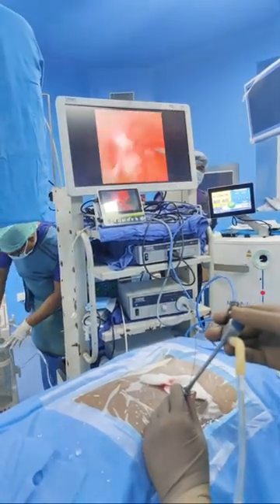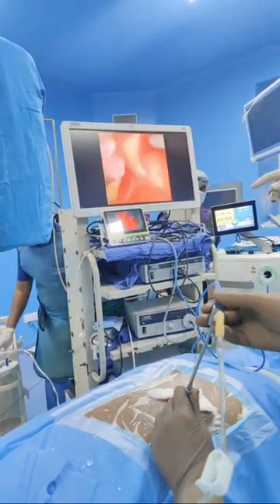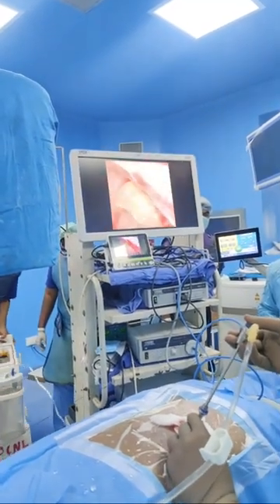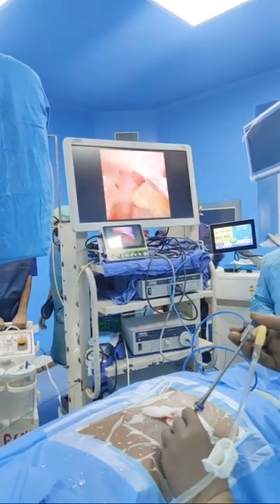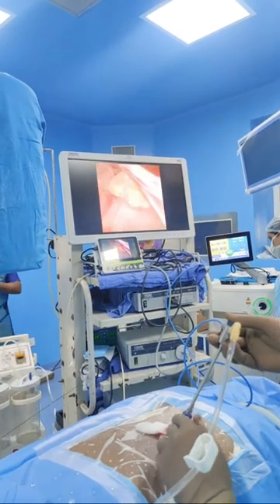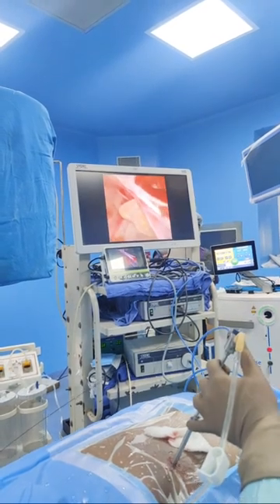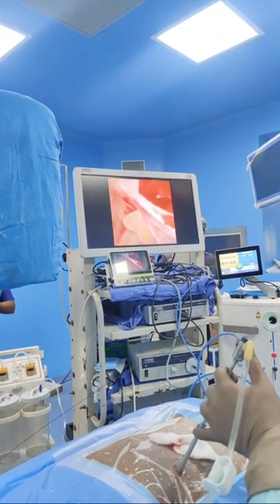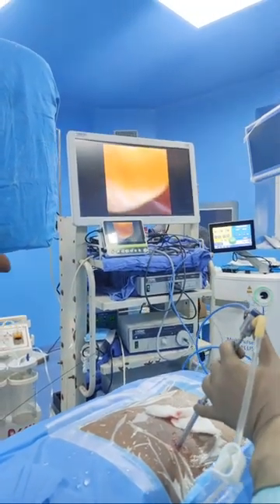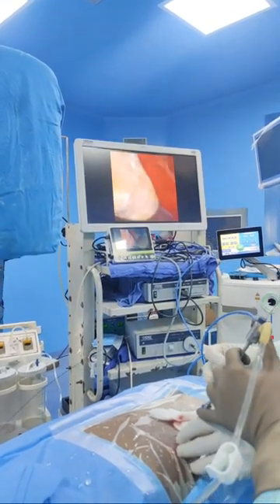We are able to see the one stone. Yeah. So one stone, here it is. So one stone is here. We will just take this stone out. Maybe this is one of the small stones that was there, with the forceps. We can remove that stone with the forceps. Just give me the forceps. Track is above, but we will remove this stone and then go to the track. Yes. Because this stone was lying in the periphery.